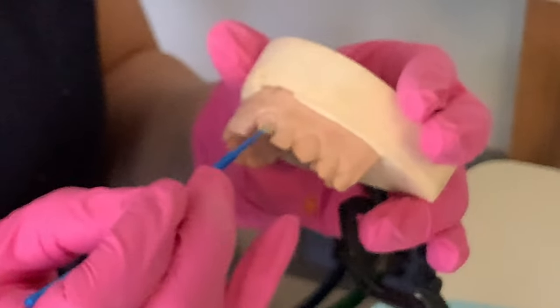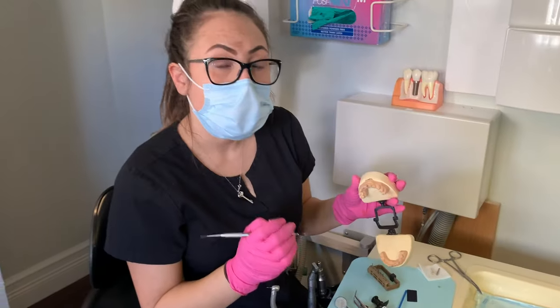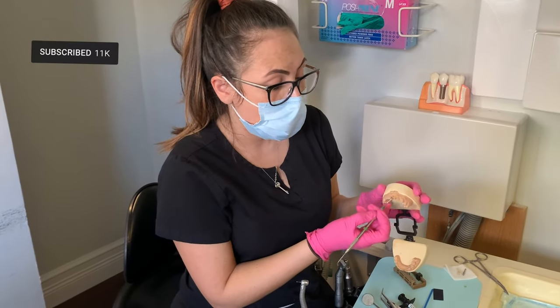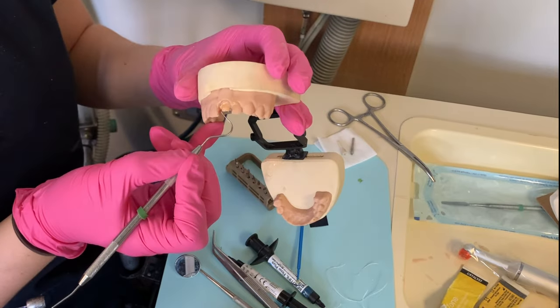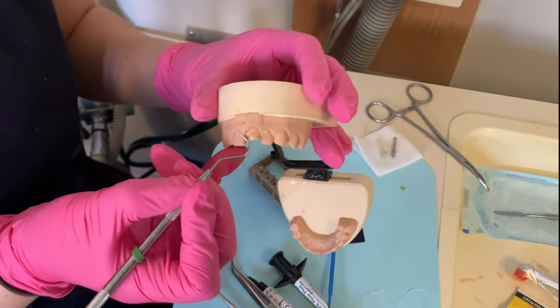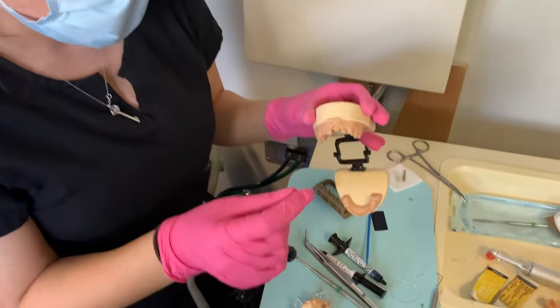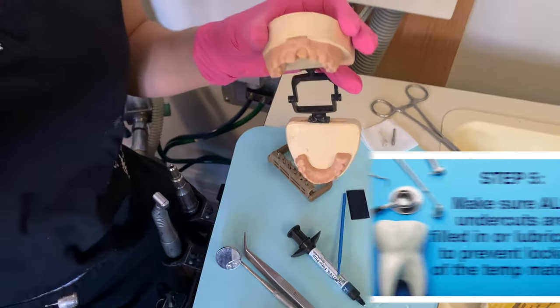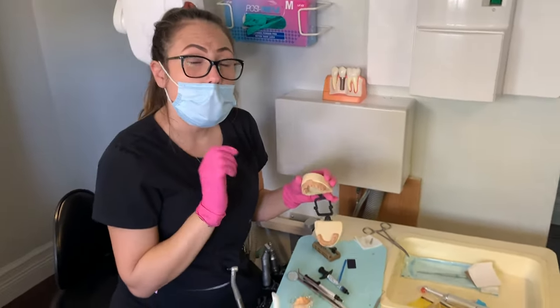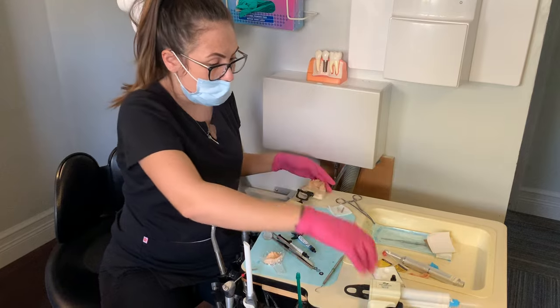Also apply it on the adjacent teeth. If you notice that the adjacent teeth have some irregularities — for example, if this tooth here has an abfraction right here — that means your temporary will probably lock right there. So either you can try using the Vaseline or the topical. I personally would go ahead and fill in those voids. All those little details, you want to make sure you take a look before you do your temporary, so it's easier for you to just remove it and shape it with no problem.